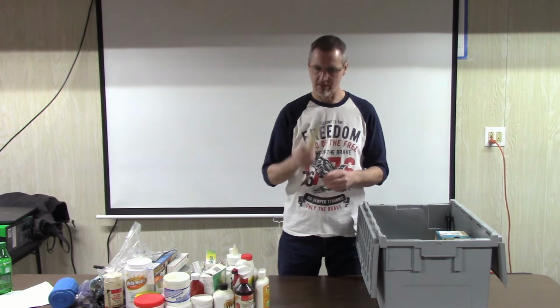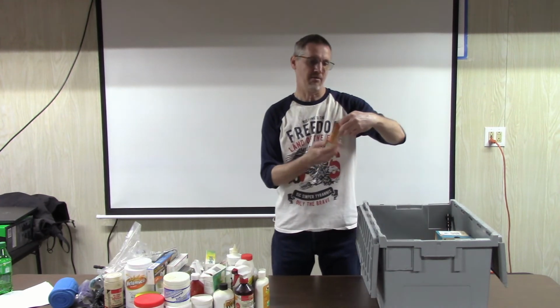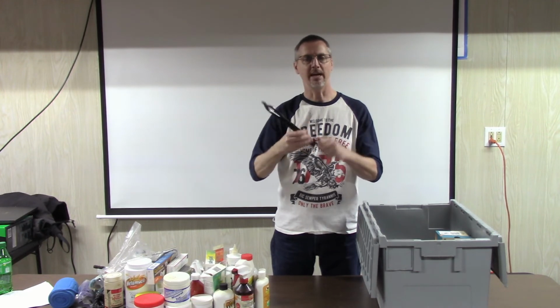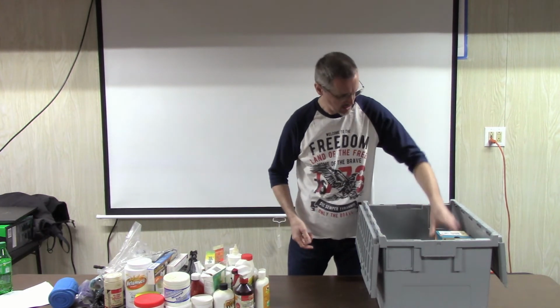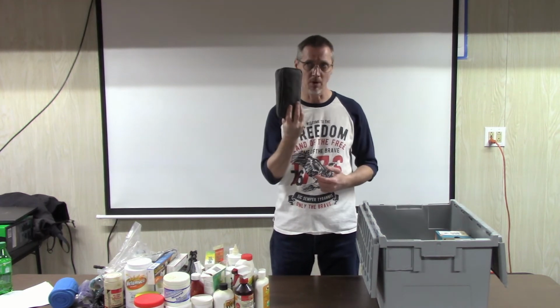Some triple antibiotic ointment. Ours are this big, animals are this big because they're bigger. Vitamin supplement. This nasty looking little device is, what's the technical name on this? A twitch. You actually put the horse's upper lip in here, squeeze down on it, tighten this up, and you can hook this to their halter, and it basically distracts them if you're doing something like behind their head that they might not enjoy. This kind of keeps them preoccupied and lets you work on them. Some flea medication. Just clippers. Yeah. Set of clippers, just like the disposable razors for people. We've got the clippers for the animals.